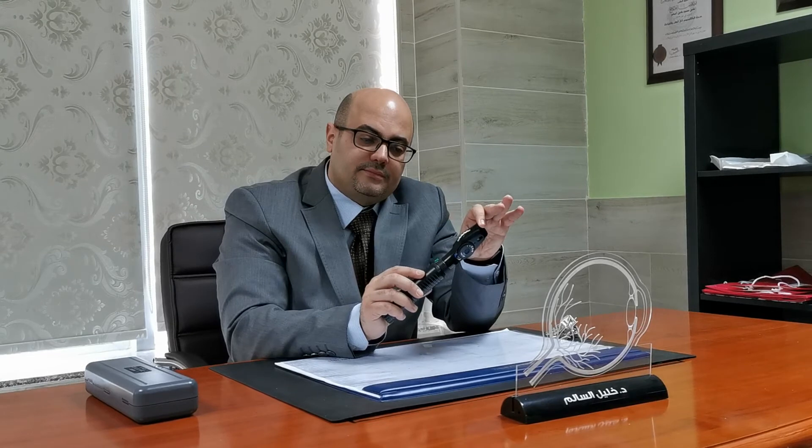Once inside the fundus, move your head — look to the right and to the left. You will find the optic nerve, which is around 15 degrees away from the visual axis. Then ask the patient to look directly into the light — this is where you can see the macula. The image created by this machine is erect, virtual, and magnified as discussed.